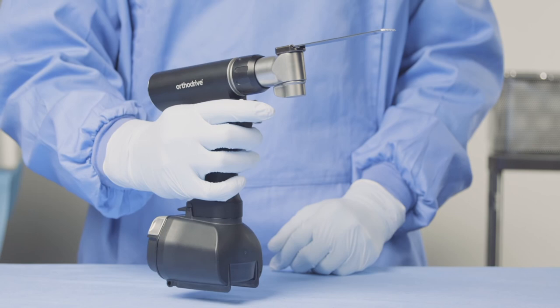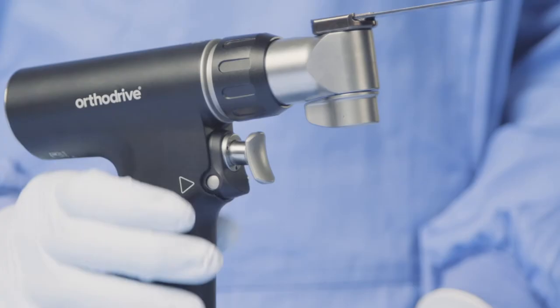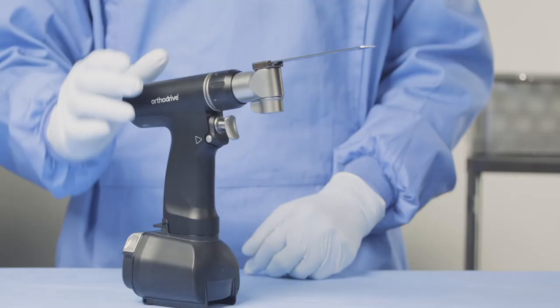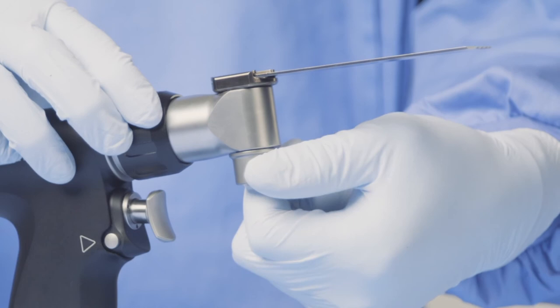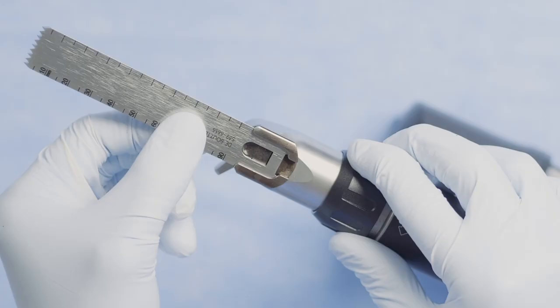To remove the blade, place the saw back into safe mode. You can then twist the lever on the bottom of the saw head to release the mount, which allows you to slide the S89 blade straight out.